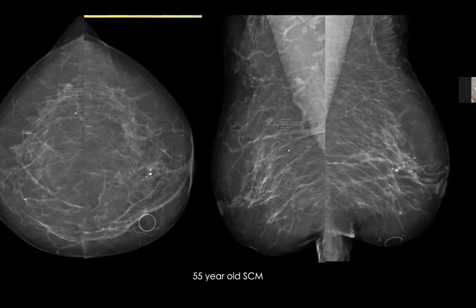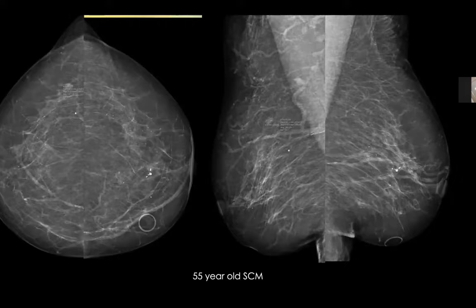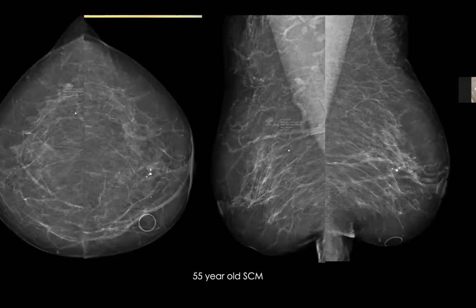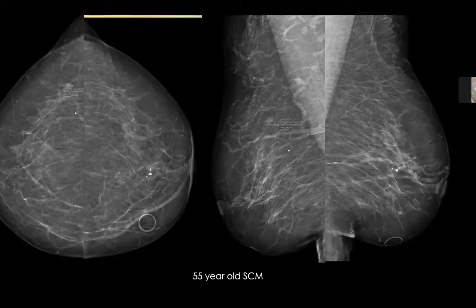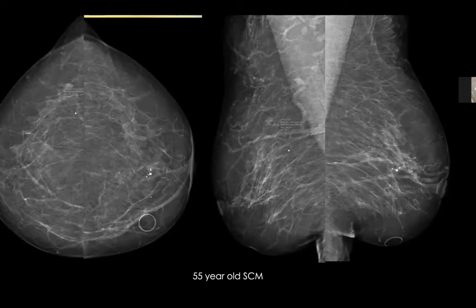There are nice concave margins of the breast parenchyma where the Cooper's ligaments attach to the skin. Keep following them, and — there's a bump right there, a density. Now we try to localize where it is. When we compare right with left, we see extra tissue on one side that is not present on the other — that tells you something is there. You want to figure out: is this a cyst or a solid lesion? If it's a cyst, you can let it go, but if it's solid you will have to biopsy it. Locate it by ultrasound.